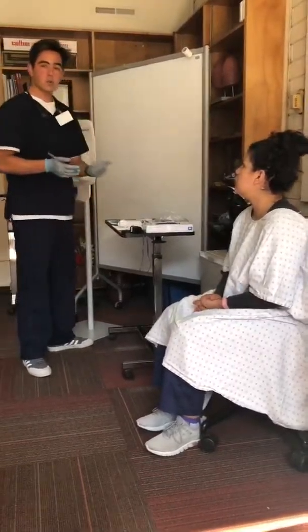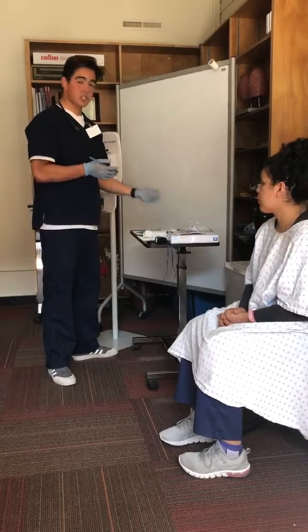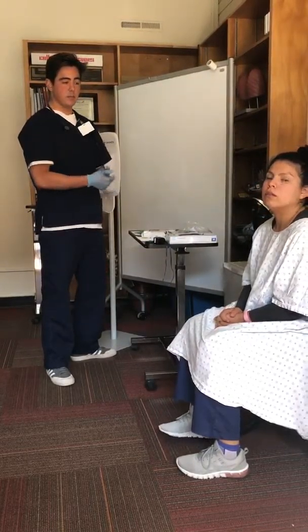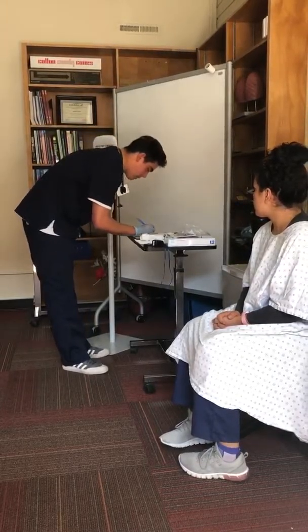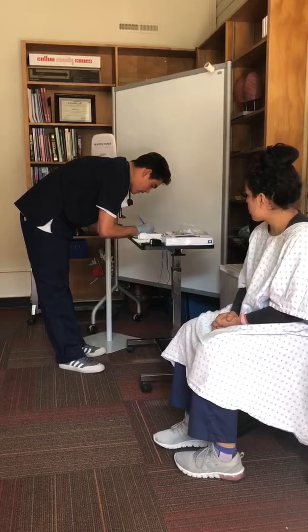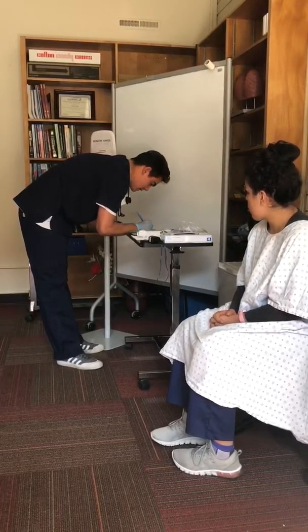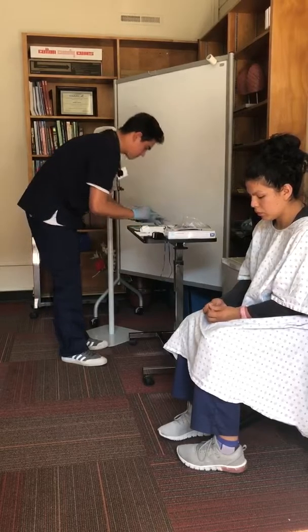We want no two results to vary more than 150 mLs to ensure good accuracy. We had good patient cooperation and effort. So we're going to do a little bit of math here. We're going to take the highest, 190, over the 418, and then multiply by 100.